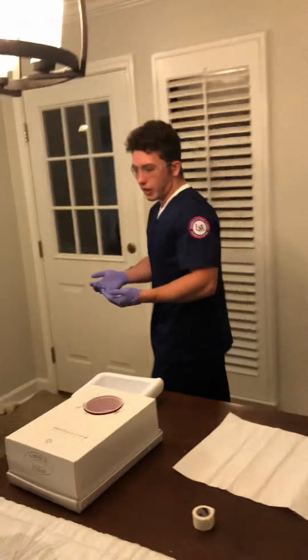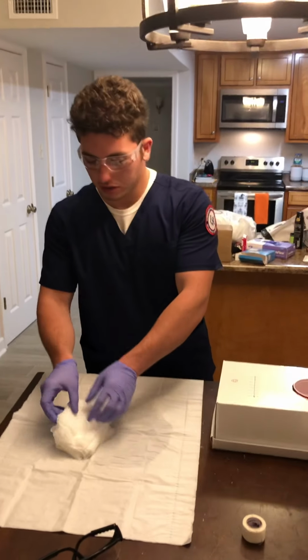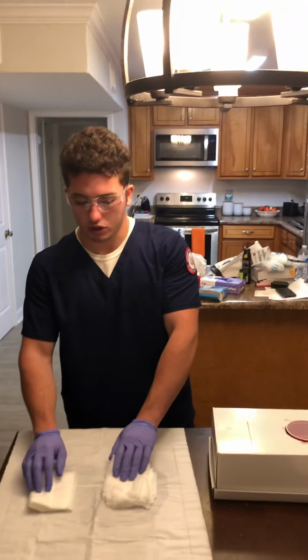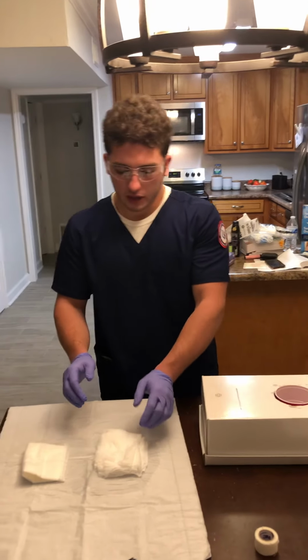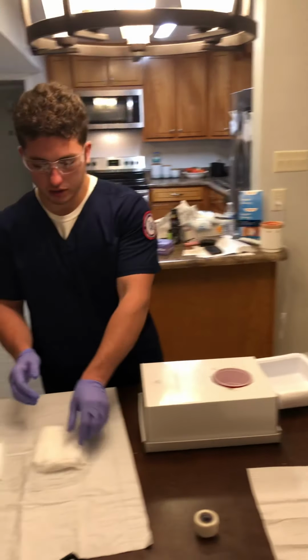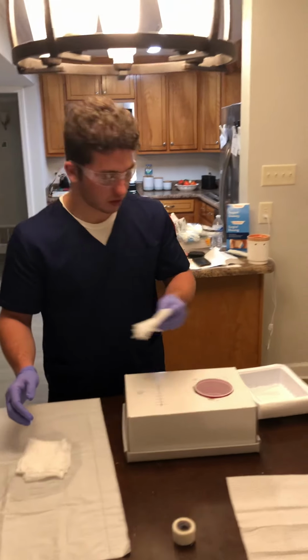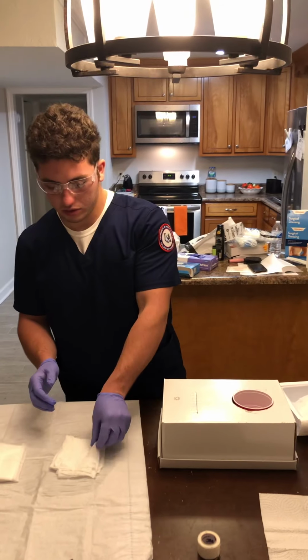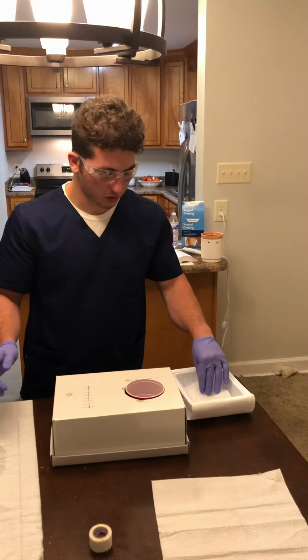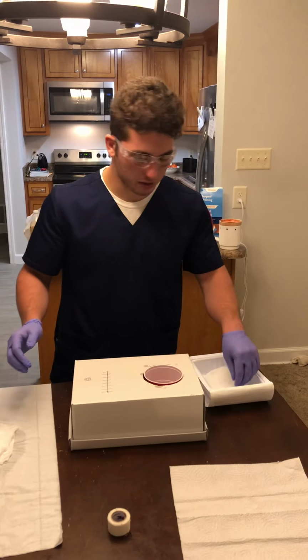Okay. Now, I'm going to organize all of my medical equipment, removing the gauze and the abdominal pads to the side, ensuring to keep it within that 1-inch border. I'm now going to take my gauze and let it soak into the saline. Ensure not to let it touch the sides of the basin, just put it right in the middle.